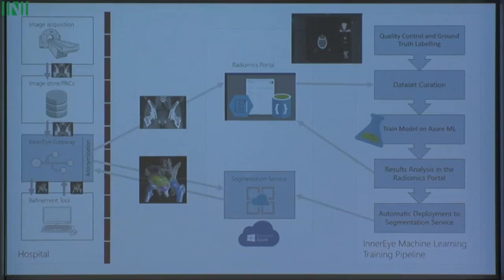So when a new image is acquired and stored in the PACS, that is also sent over to our gateway, and the gateway anonymizes and compresses the image, as you saw in the demo earlier, and sends the image to the cloud. After that, we fetch the result and put it back into the hospital database, and this creates a seamless workflow where clinicians have the results available to them when they open the image.